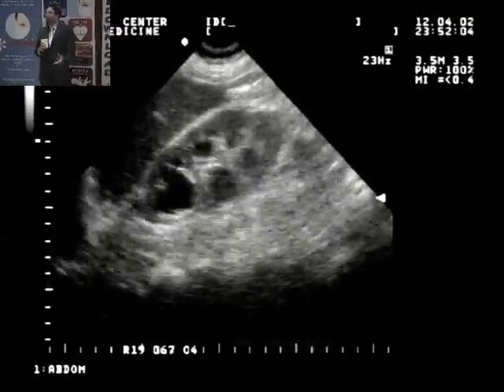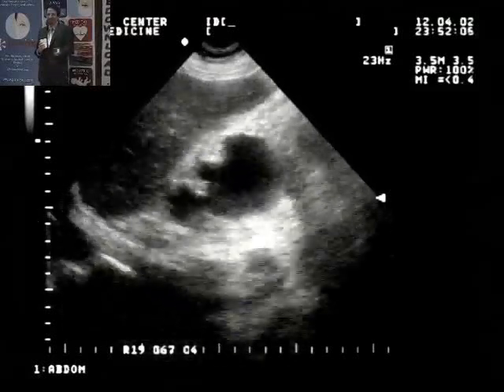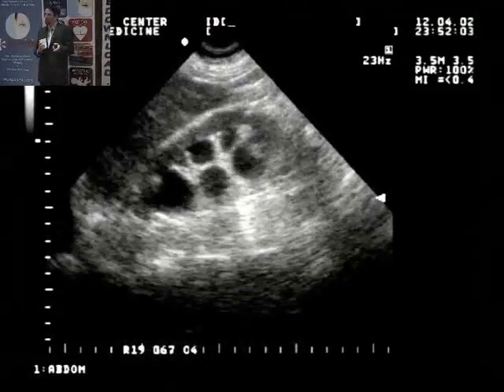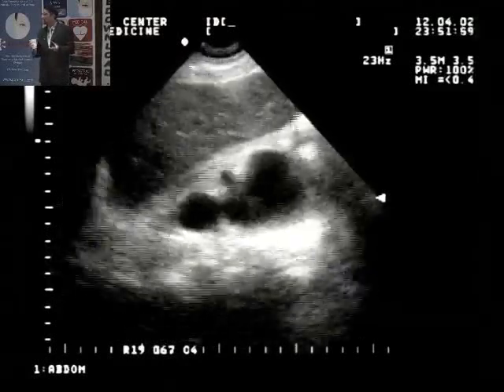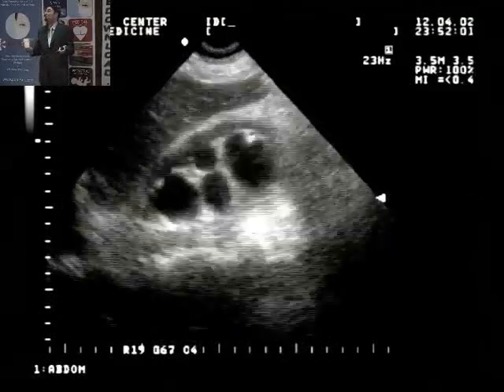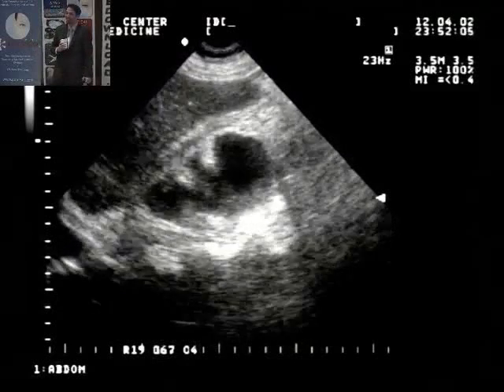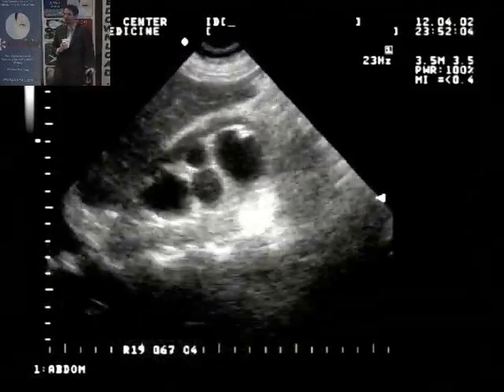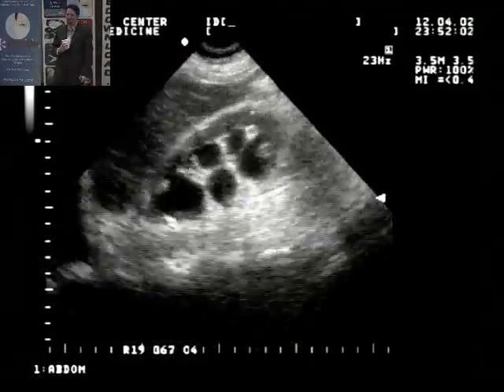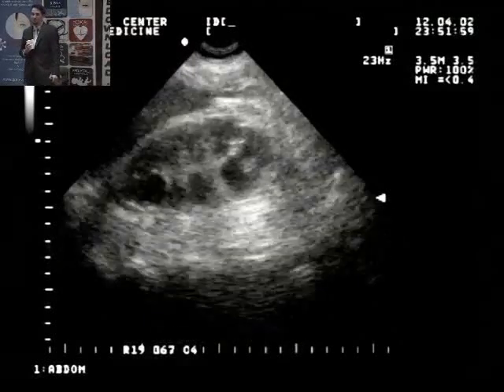I use just kind of a gestalt. So this is severe hydro. You can see that the renal architecture is pretty damaged. You've seen some cases of mild. Moderate is in the middle of that, and I don't have a more scientific explanation than that. I don't do much beyond distinguishing between severe and somewhat less than that. So, between normal and mild hydro.